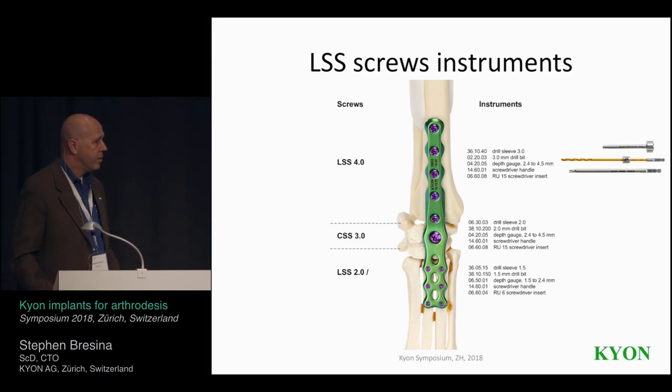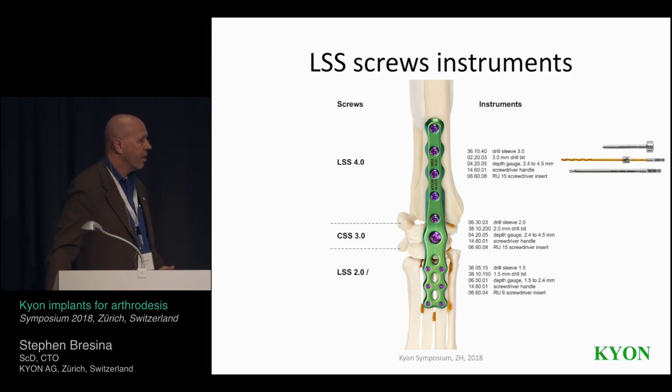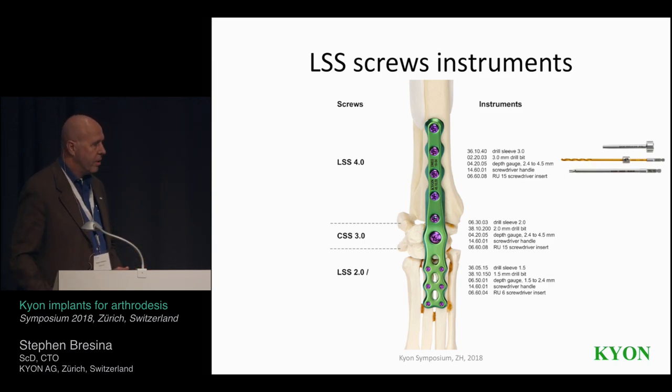Yes, please. Is there any bending intended, or are there special bending instruments for this? We have bending instruments, but these pre-contoured plates, it's felt that there's only a minimal amount of contouring that's required.